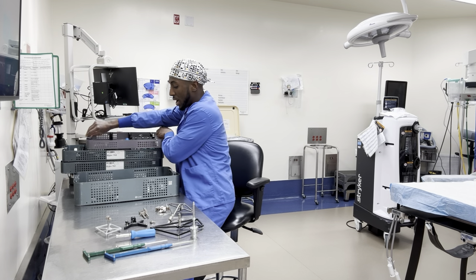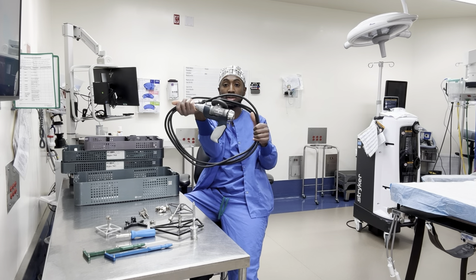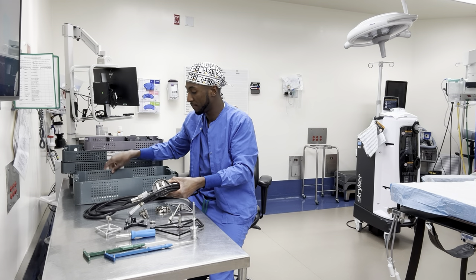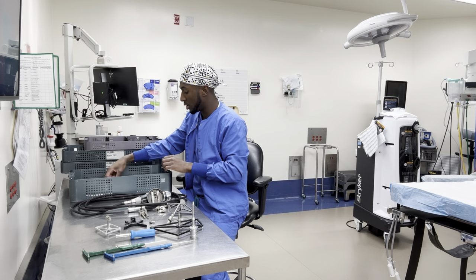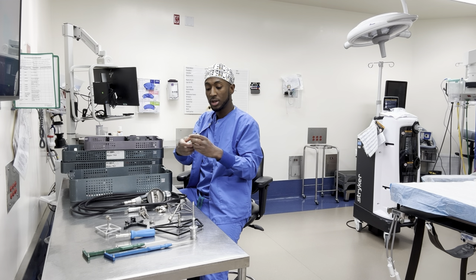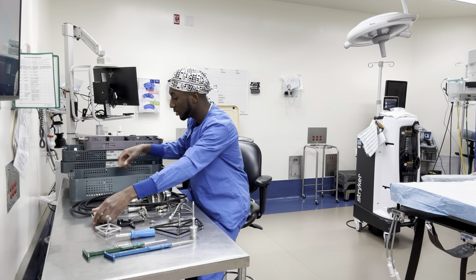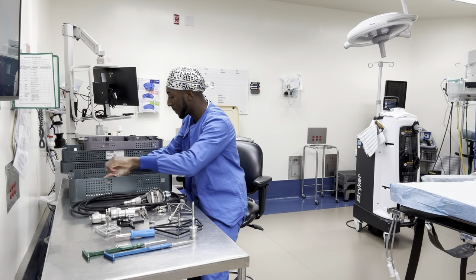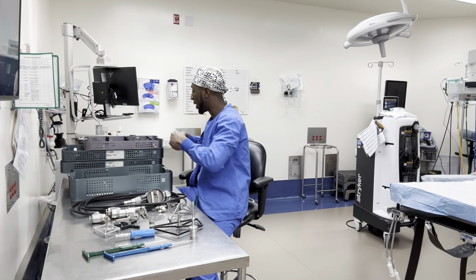On the bottom of this tray is the Mako handpiece. There's also the piece that the blade goes into, and then the wrench. That's everything pulled out of the TK1 tray.